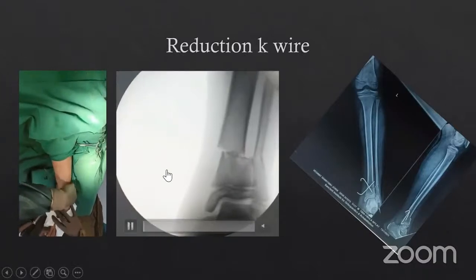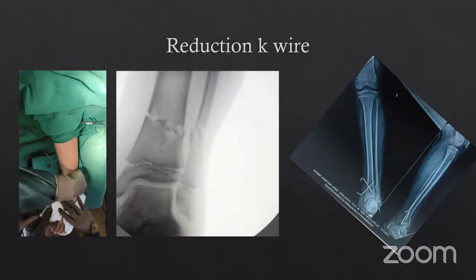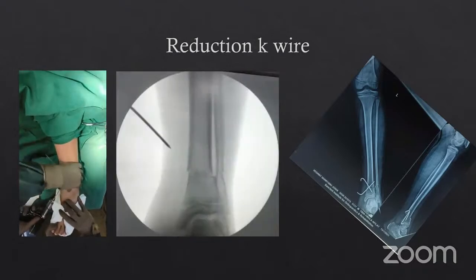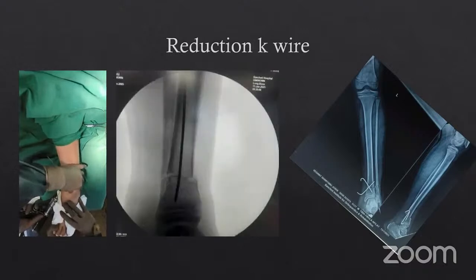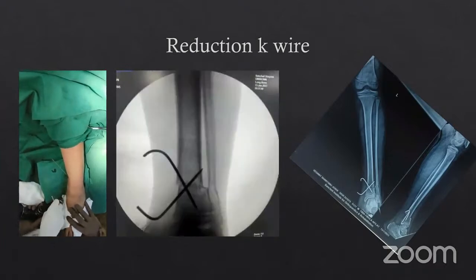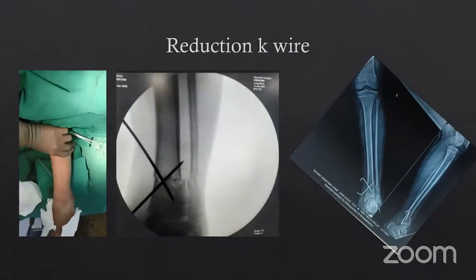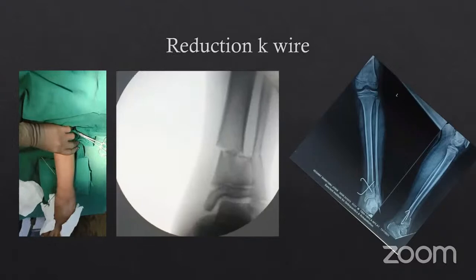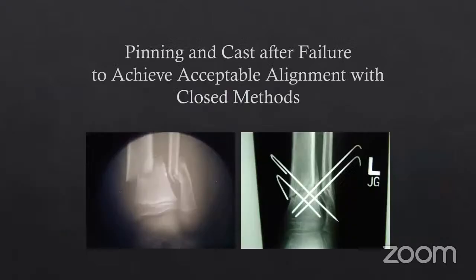And this is to show you how the reduction was achieved and the K-wires being passed just to hold the pieces together. One wire from proximal to distal and the second one from distal to proximal. Check in both views just to hold the reduction so that it doesn't slip. And then a cast was given. So a very small percutaneous technique to hold a fracture, and that is how you can achieve reduction. And in a couple of months, you can remove the wires once callus is seen in about 3-4 weeks. Carry on with the cast and it does very well.